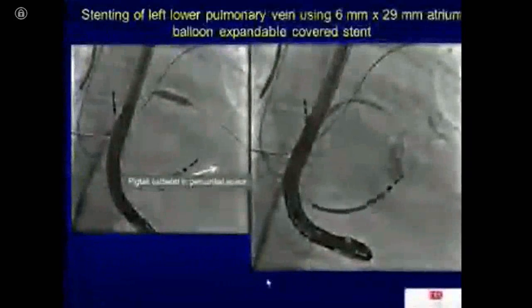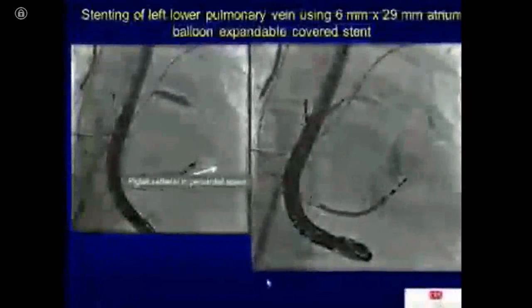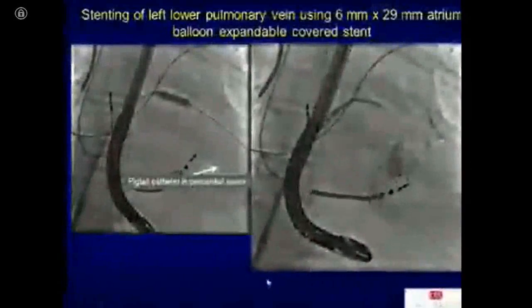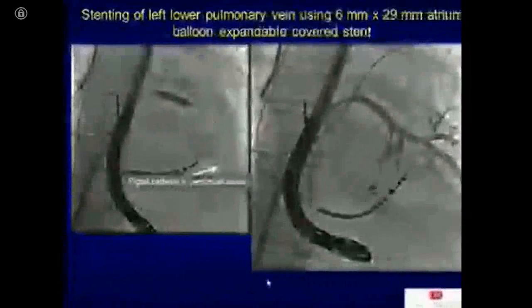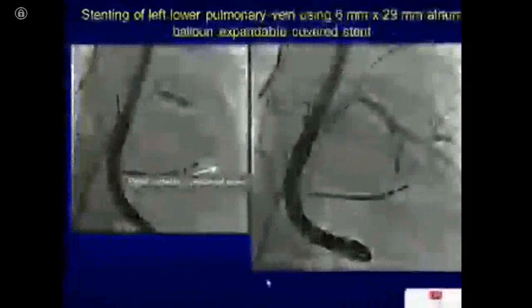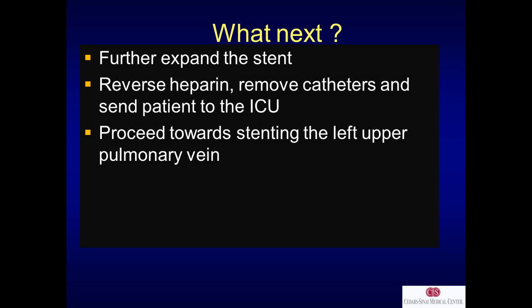Okay, so everyone said, come on, Saibal, you've done a good job, stop it. I said, no, wait a second. He has an 80% stenosis up there, and we have a pericardial catheter in place. If he ruptures again, we have a pericardial catheter in place. And there's a surgeon on standby. So why not fix that? So we said, forget it, we just fix that too.